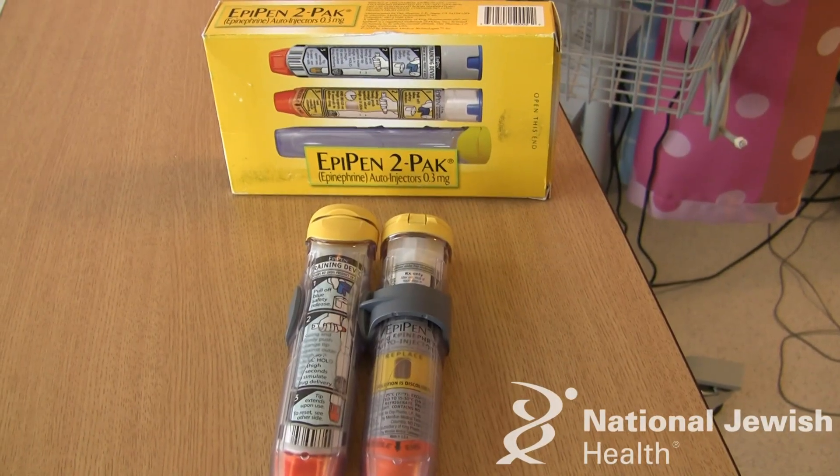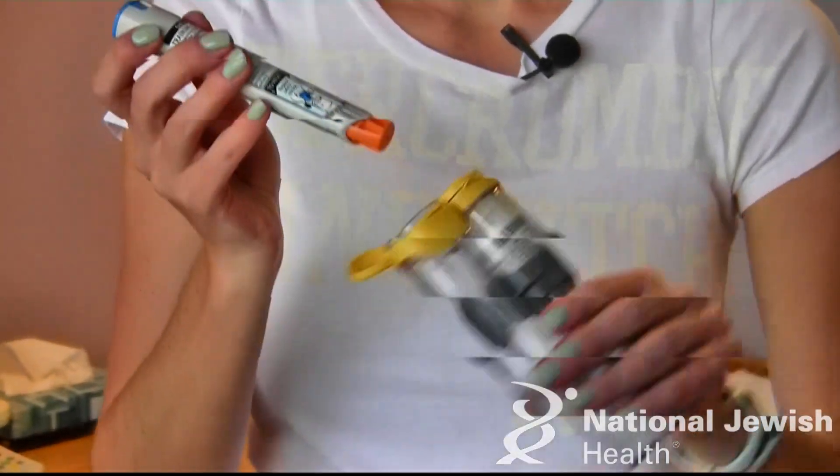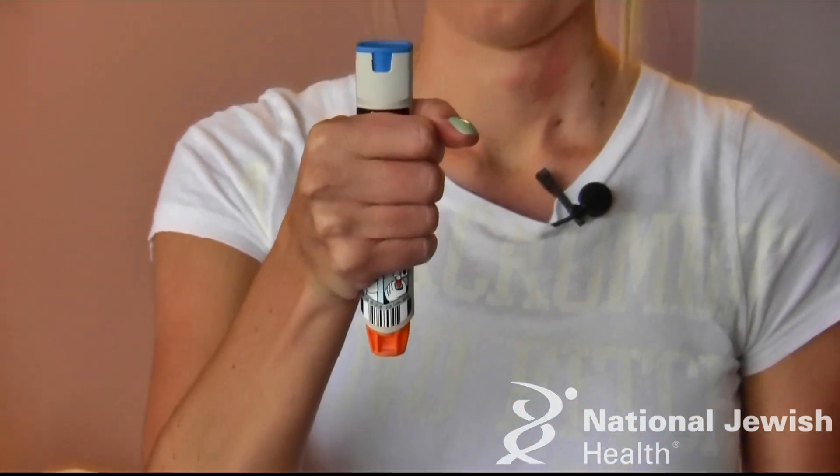The EpiPen comes in a two pack like this. You remove the EpiPen from the plastic container. You hold the EpiPen in your hand tightly within your palm. You never want to cover any of the openings, the ends. The orange end is going to be the needle. The blue end is what you're going to pull off to activate.